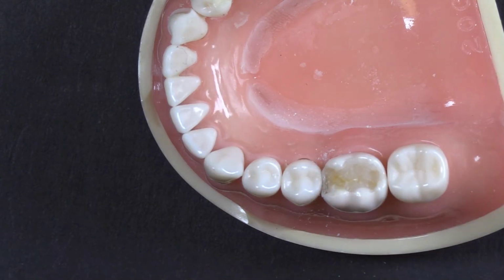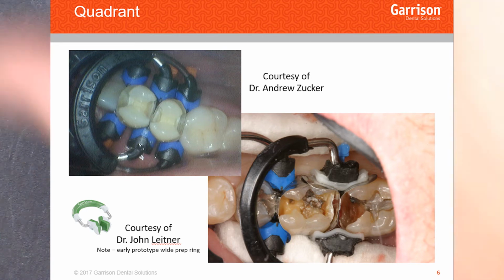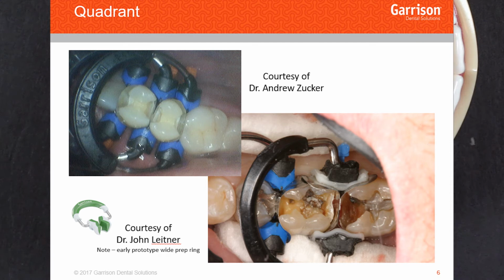and feel if you've removed that overhang. The next most common question was dealing with multiple tooth restorations. And these are certainly our most challenging restorations with a sectional matrix system. You end up with a tremendous amount of hardware in there. The placement of the rings between all of those matrix bands can become quite difficult.